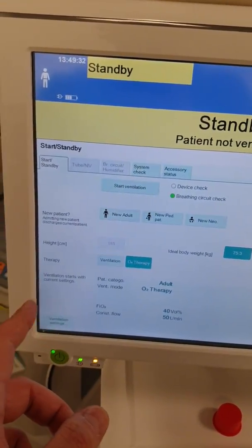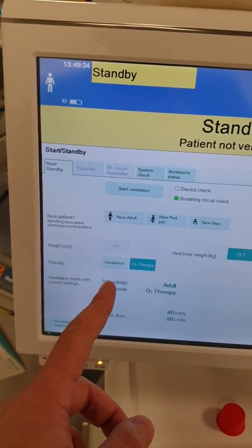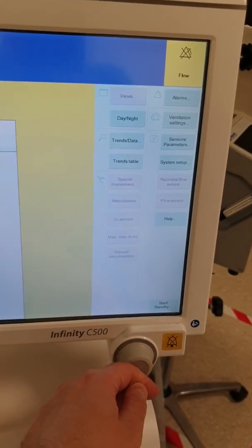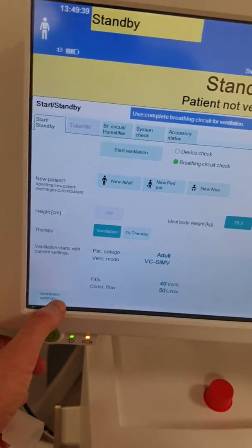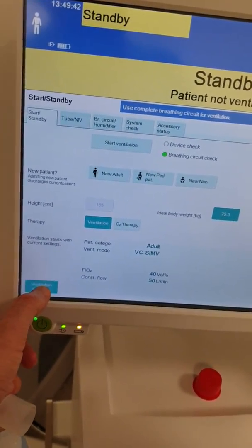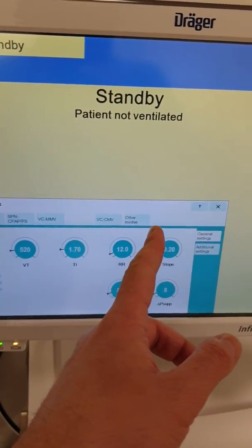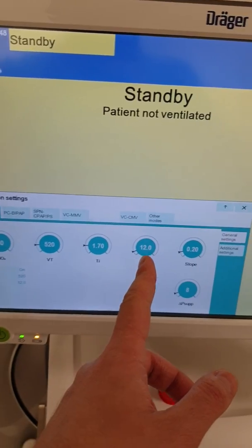Now let's say we're going to the ventilation modes. We're going to switch to ventilation and press OK. Then if you go to ventilation settings, you can select your mode of ventilation and change your settings.